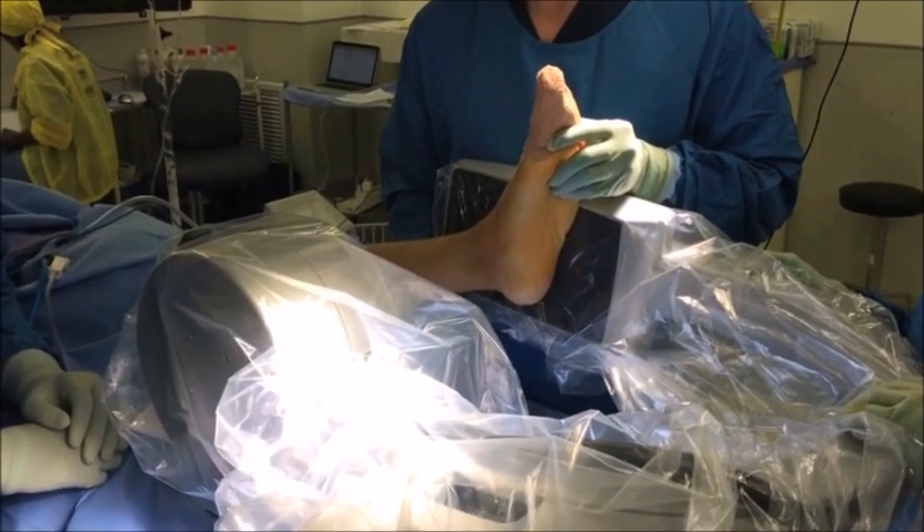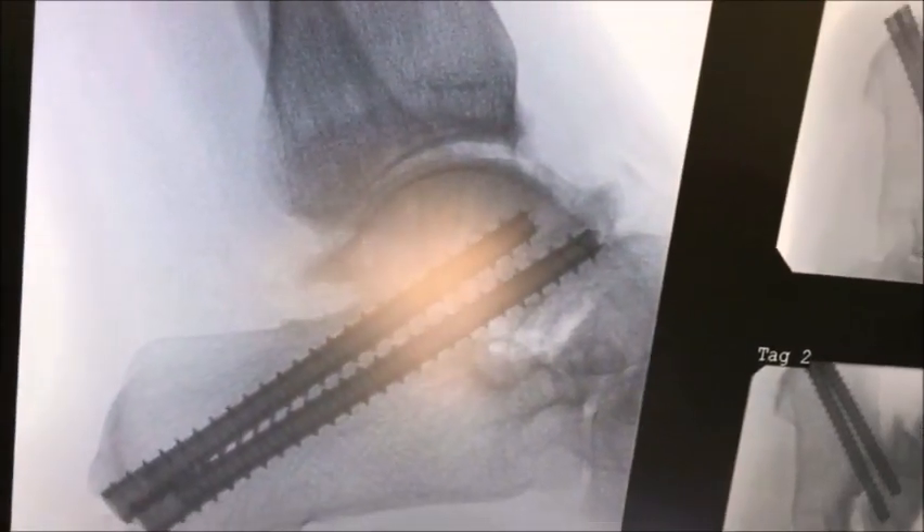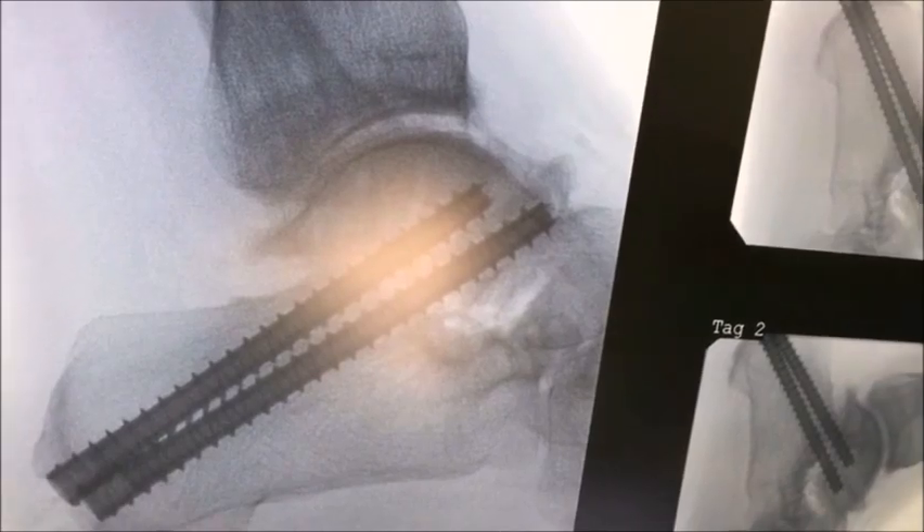Fluoroscopy is once again used to confirm correct position and length of the screws inserted. It's also good to check that good compression has been achieved across the fusion site.